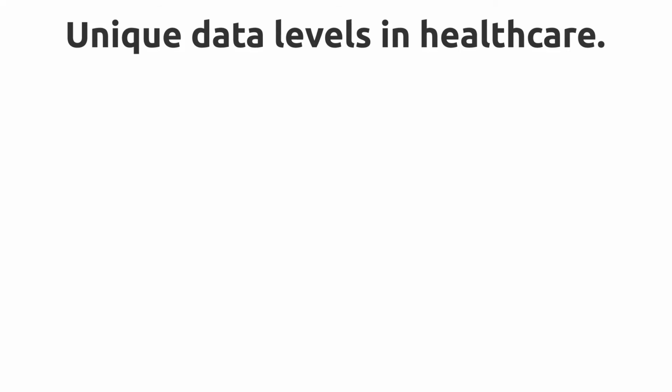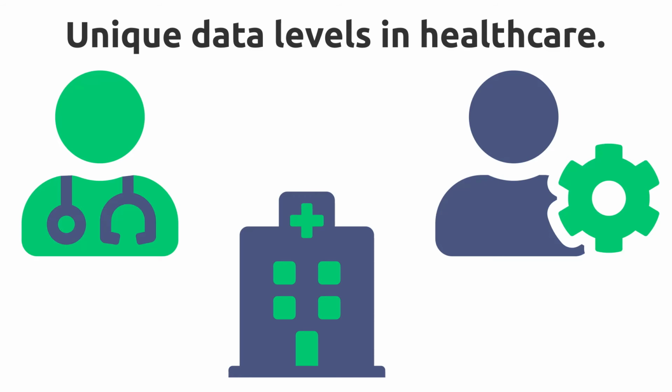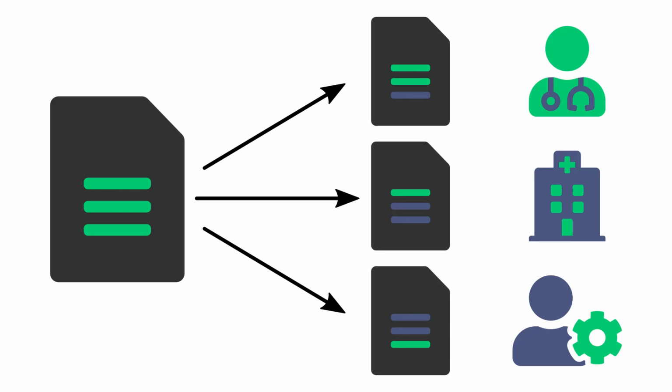In the healthcare industry, each actor has a unique data level to see and handle personal and sensitive data. This level is different when we talk about a specialist, a research center, or the maintainer of a medical imaging machine. With a well-labeled DICOM structure, it is easily manageable.